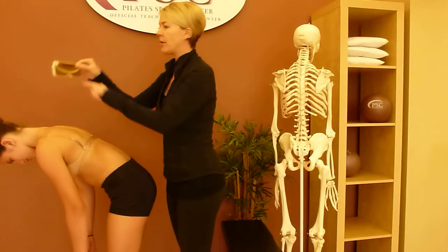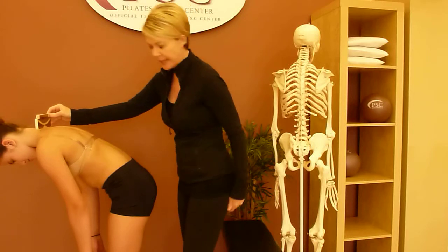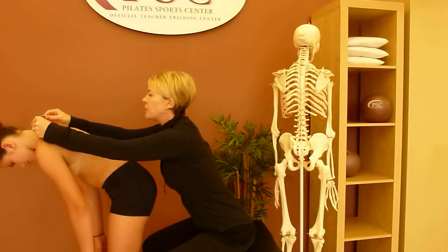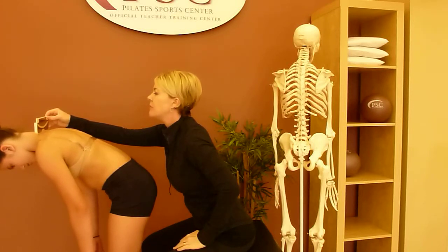We're going to begin with the scoliometer, with our little cutout and the center of the spine at the top of the spine, base of the neck. I'm going to get down on my stool so I can get an accurate visual, and I'm not going to push down on it at all. We want to get an accurate reading with it resting comfortably.